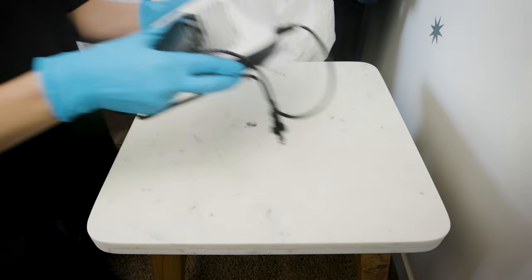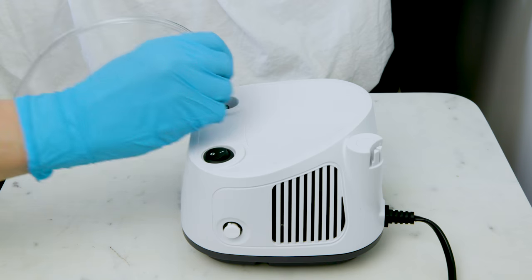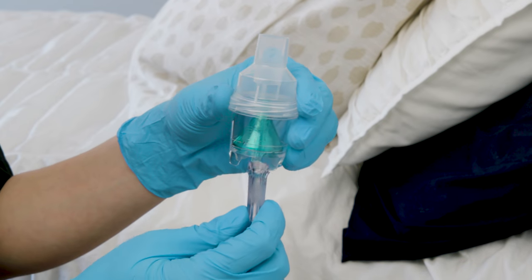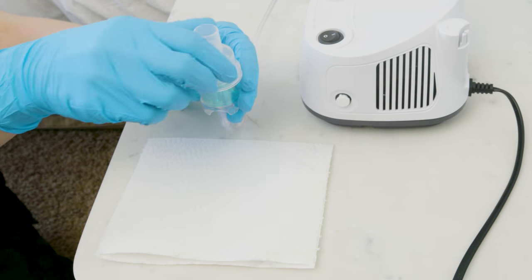Put the neb machine on a hard, flat surface and plug it into an electrical outlet. Connect one end of the neb tubing to the air outlet port on the neb machine. Attach the other end of the neb tubing to the air inlet port on the neb cup. Remove the cover from the neb cup.